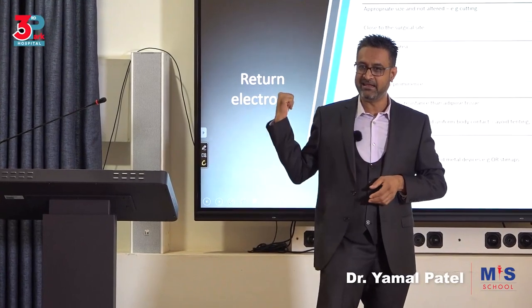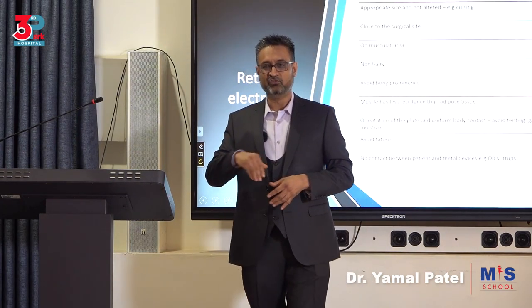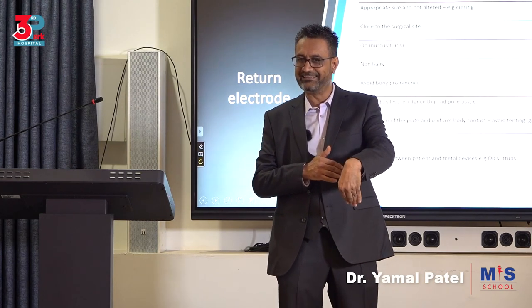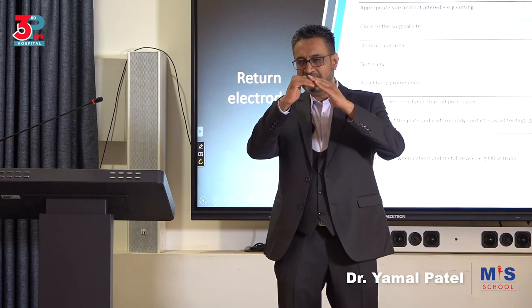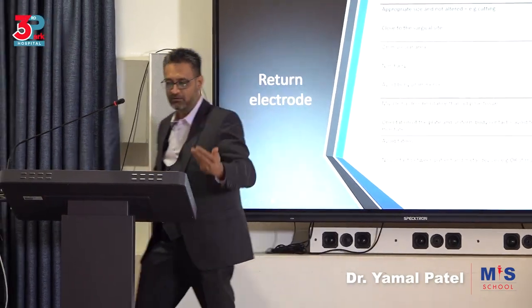So saline is not a problem. It's a friend in electrosurgery. It will disperse the electricity better. Okay? So if you have to wet it, use saline. Not so with the sticky ones, the blue single-use ones that we have. The reason we don't want fluid on it is not because it will cause a short circuit. There's no short circuit here, but it will create a detachment, and it will not allow it to stick well. You get what I'm saying? And because of that, it will not work well.